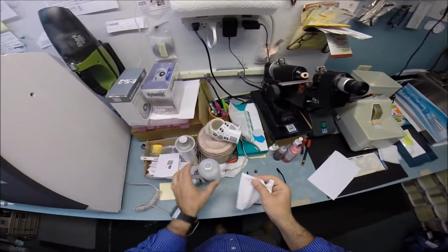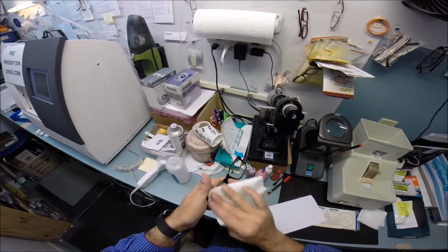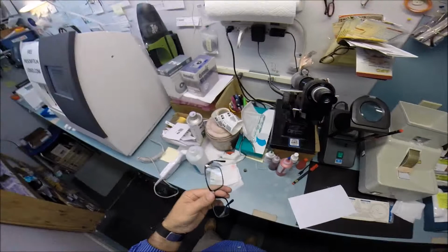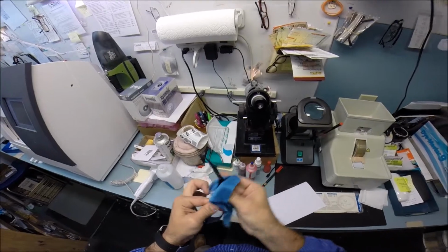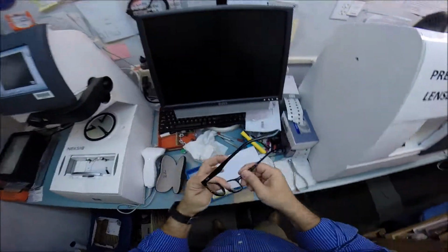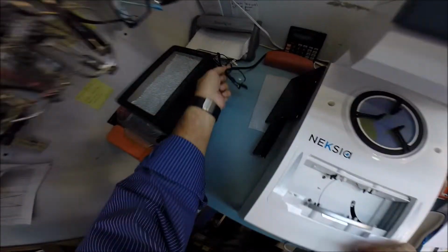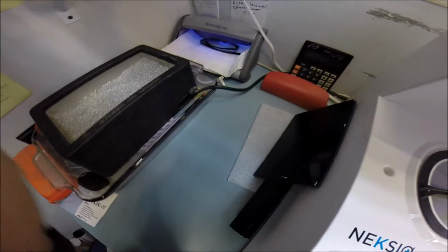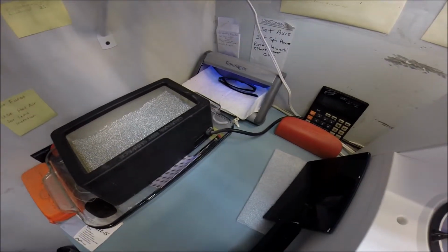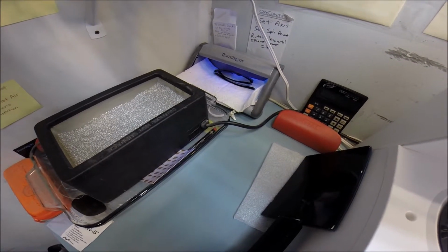These are yours, and they may be already pre-adjusted. But I want to clean the red dots off, because now I'm going to turn your lenses from clear. I'm going to activate the transitions in your lenses, which are a whole bunch of little molecules that when they are exposed to a strong dose of UV light, start to dance around and turn dark. So these are your lenses. They are virtually clear while they're indoors. I'm going to expose them to a strong burst of UV light in my little transitions box back here. I'm going to hit the button and turn it on, and as you will see, all transition lenses take about 30 to 45 seconds to darken when you go outside. It takes 45 seconds to a minute to lighten when you come back inside.